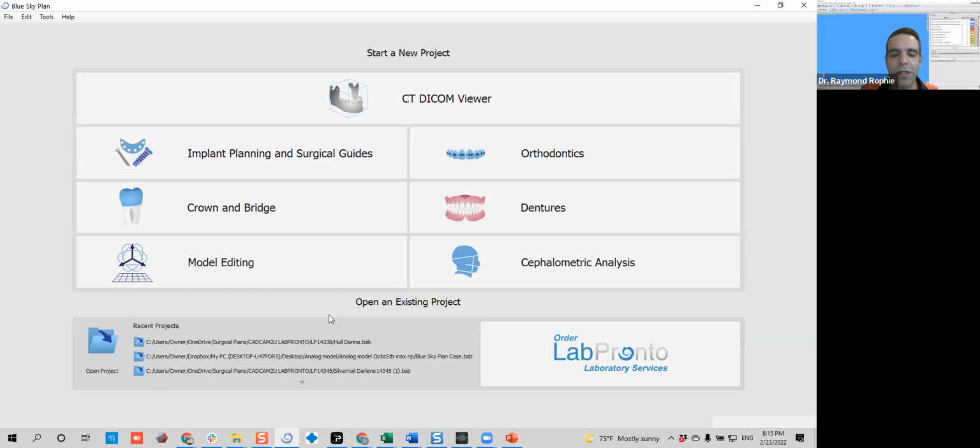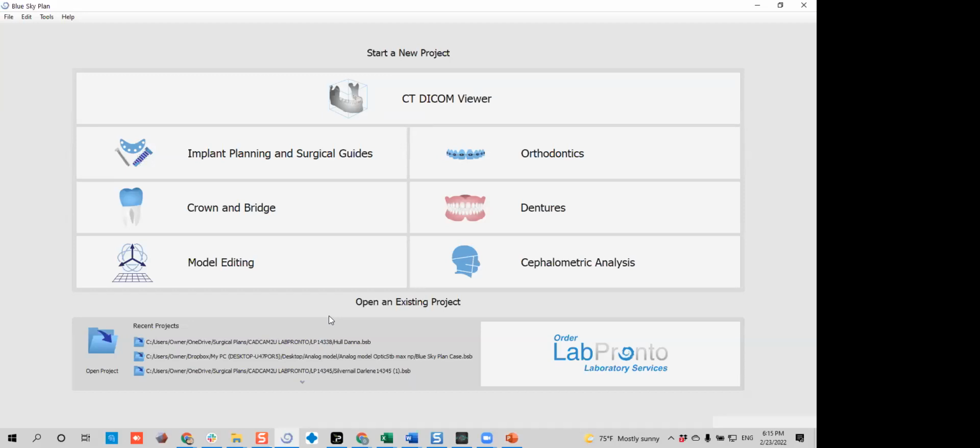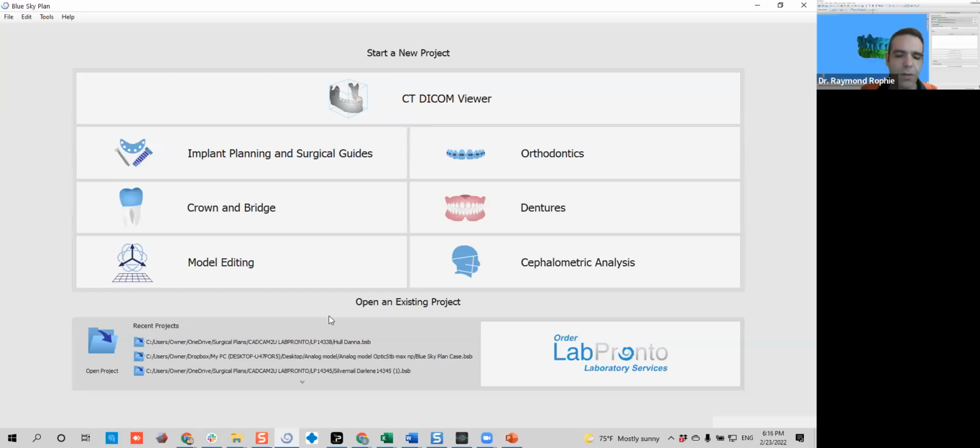So we will start, continuing what Dr. Robert Miffley reviewed in the last webinar. If you haven't seen it, please go ahead and check it out. Definitely, it's worthwhile. So continuing that webinar, I will work today on the advanced module.